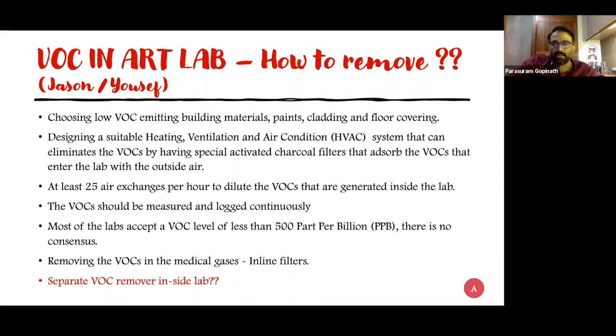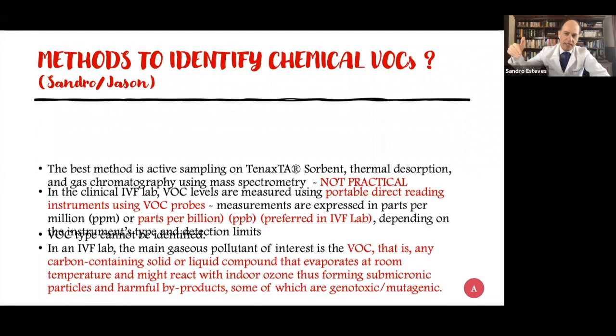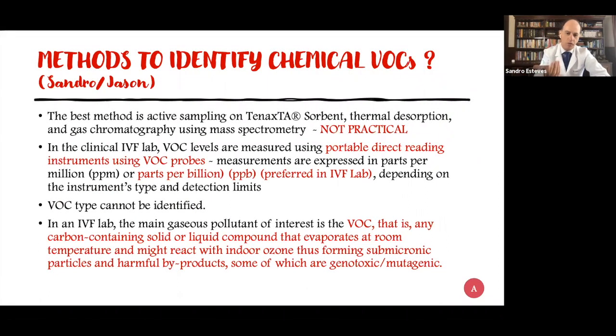Somebody can add in. Sandros? Well, I can contribute. The units inside the labs are useful, but one thing we need to remember is that all these meshes, which are made of activated carbon, permanganate, etc., could release some particles. So it's important that after the chemical filters, we have fine dust filters and then the HEPA filters. Most of the units being commercialized have a flow of pre-filters, then the chemical filters, and then the HEPA filters, but they do not provide positive pressure.